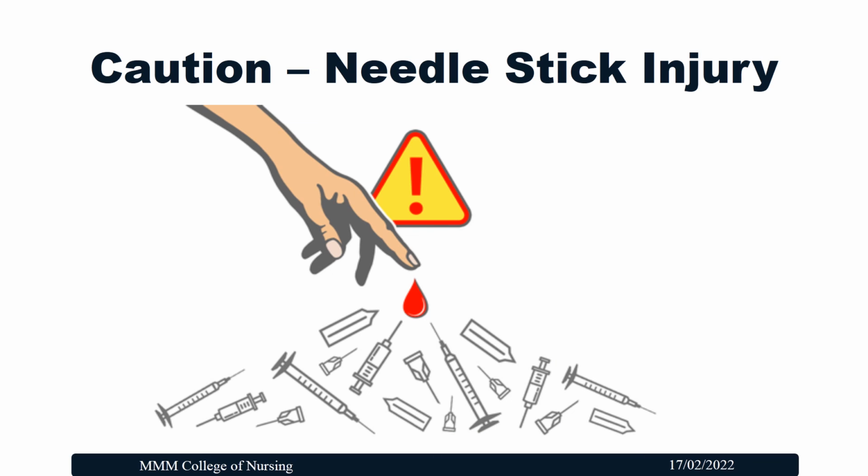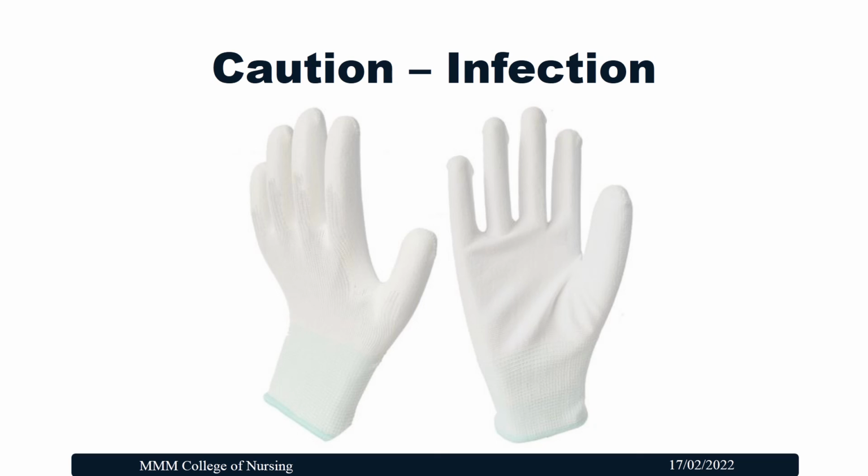In injection and infusion procedures, as we are handling sharp items, there is a risk of getting needle stick injuries. So always take caution to prevent needle stick injury. Since injection and infusion procedures have a chance of contact with body fluid, always remember to follow infection control measures like wearing gloves.